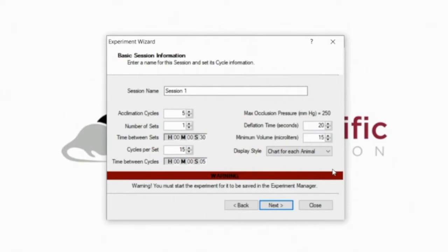This includes acclimation cycles, which are practice measurements before you start recording, and the number of regular cycles, which will be your data measurements. Kent Scientific recommends at least 5 acclimation cycles to allow for any adjustments that need to be made prior to data collection, and a minimum of 10 to 15 regular cycles per session.